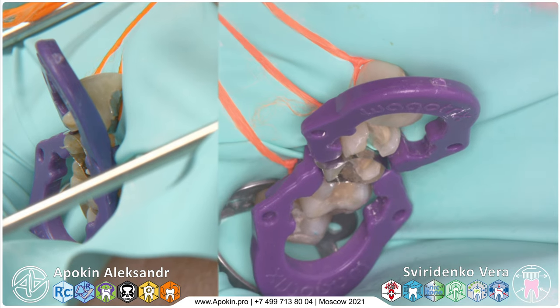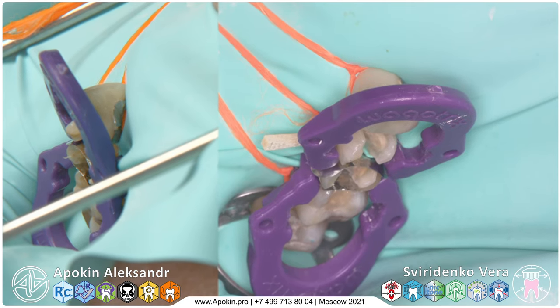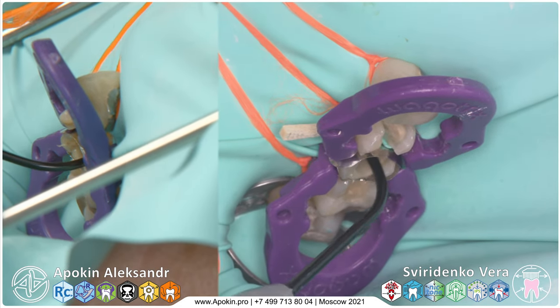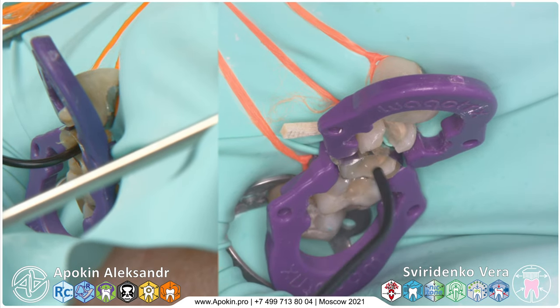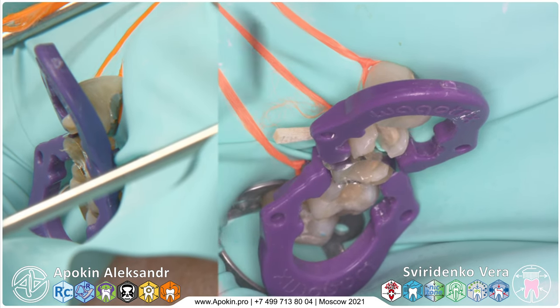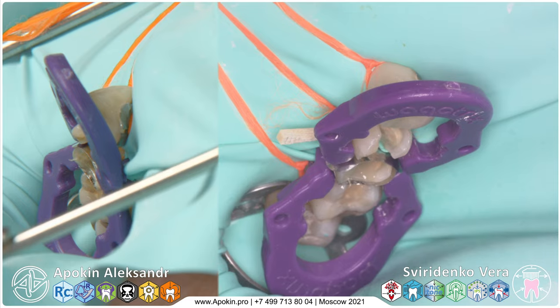then between 14 and 15, insert an interdental wedge. This is good for fixation. And then cover it with the composite. We built only one distal wall. And because we did not make the wall on 14, we can make in this step an additional mesial wall on 15.